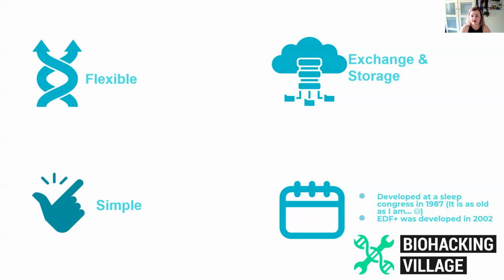Plain and simple. Now, a signal in an EDF file, in an EDF data record, is a series of 2-byte samples. These subsequent samples represent integer values of the signals which have been sampled with an equal time interval. So these signals are kind of what helps us visualize: was the patient breathing? Was the machine responding? Were there any events? But I'll get into the kind of signals and annotations you find on these files a little later.